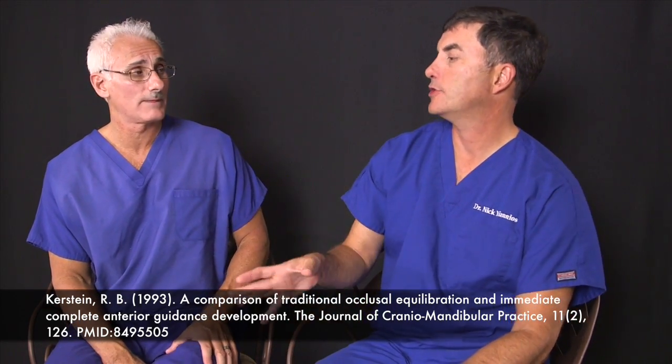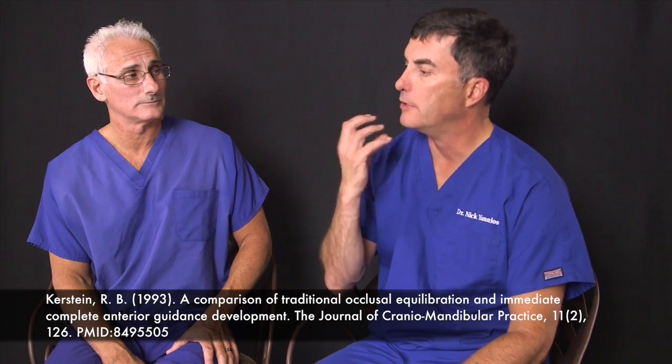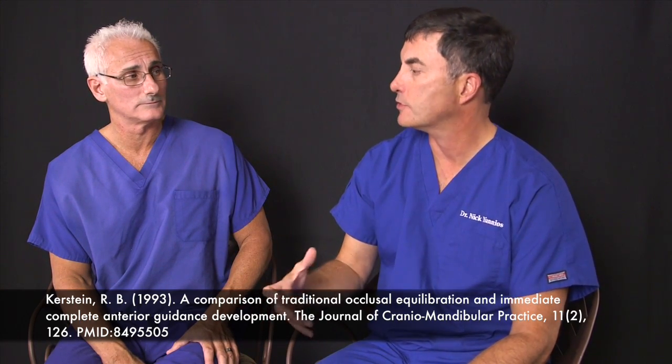And it's not iatrogenic. In other words, the dentist isn't performing a movement. The patient's own muscles are taking them to where the muscle wants to go. It's not operator assisted. So this is natural, the patient controls all the movements themselves. That's a huge difference in my book between equilibration and ICAGD, which is how we perform DTR. We are doing something very natural, whereas the people doing equilibration are doing something I consider relatively unnatural.